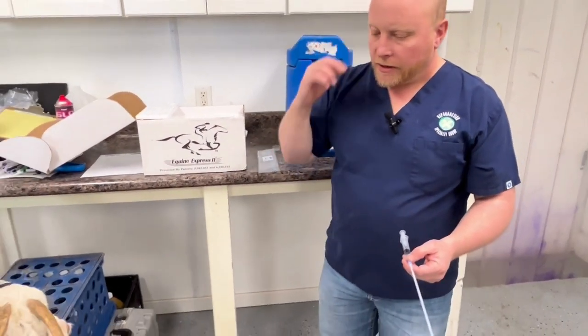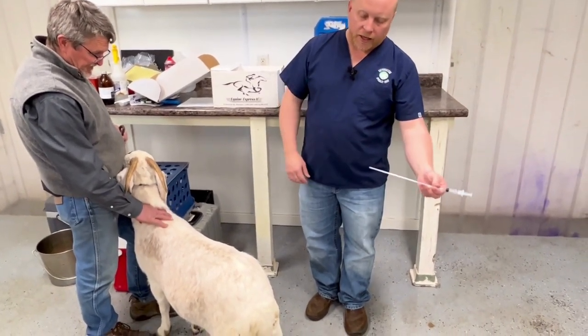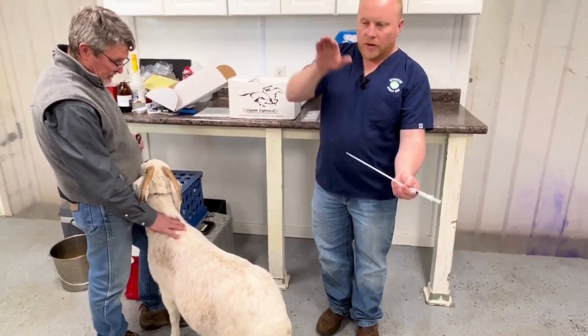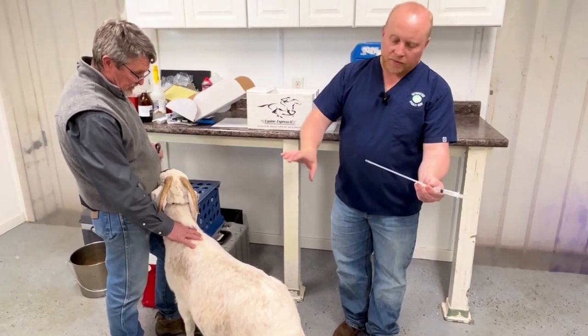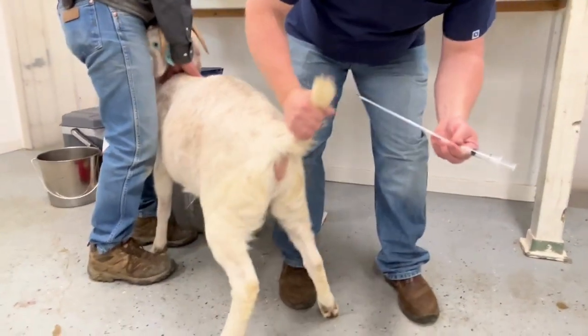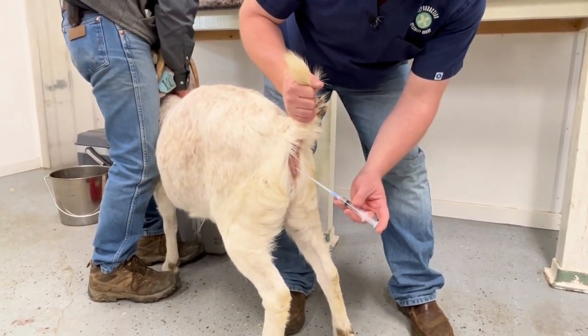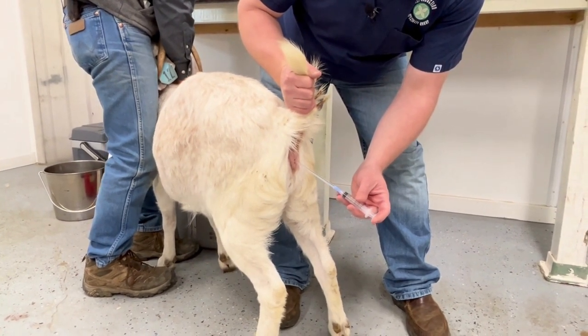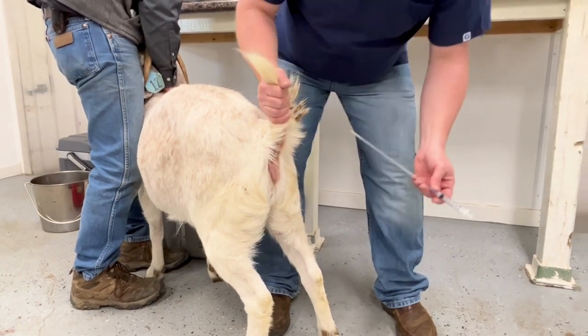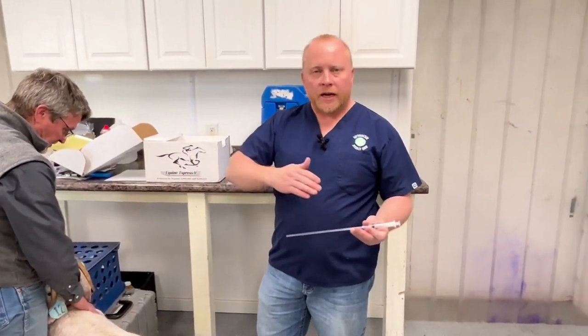The doe is in heat, so we want to direct the pipette into the vaginal vault, going up a little bit toward the sky to get over the pelvic brim. The cervix typically sits up and to the right in most situations. With the doe in front of us, take hold of the tail, direct the pipette in — you'll feel some resistance at the front of the vaginal vault — then pull back just a little bit and dispense the semen, then withdraw the pipette. If you use much over one milliliter of extended semen, it's going to run out on the ground and won't be effective. One milliliter is a nice working volume that gives you the ability to get your splash done.